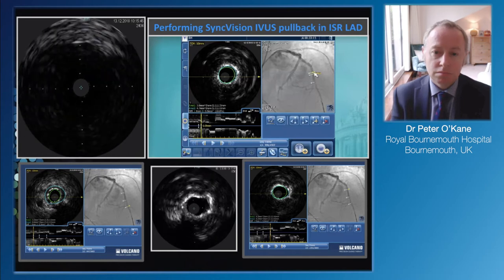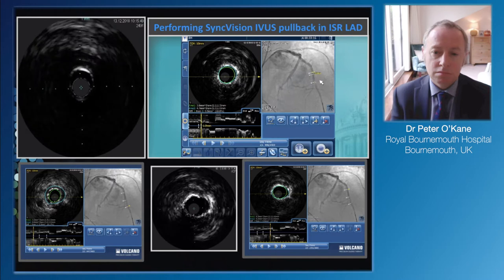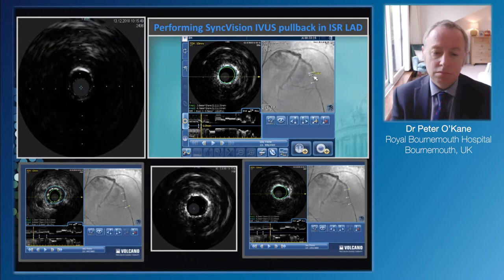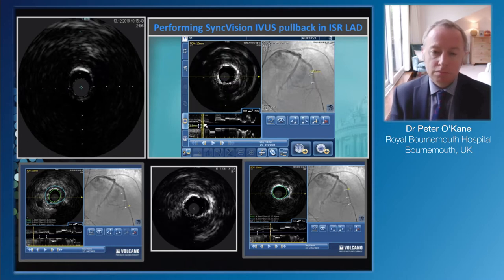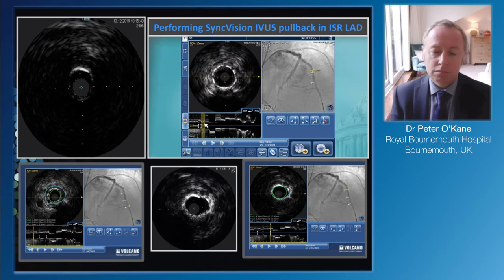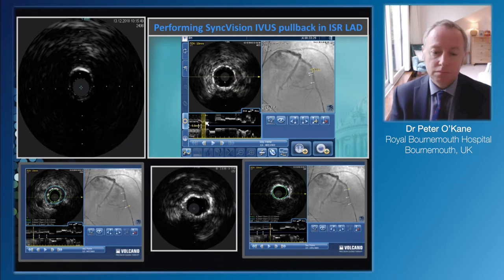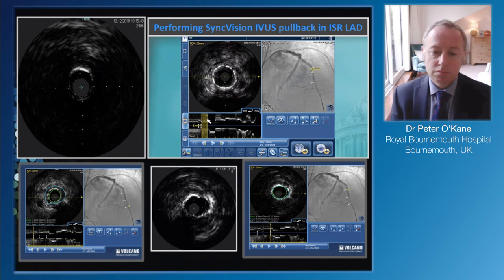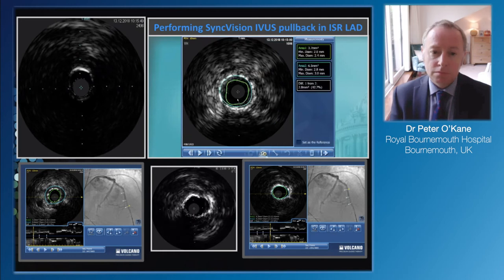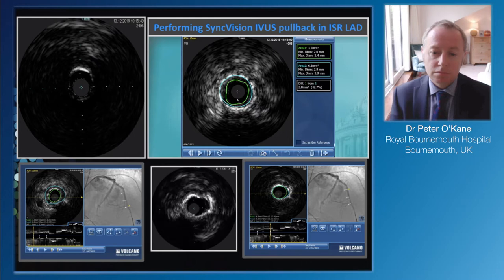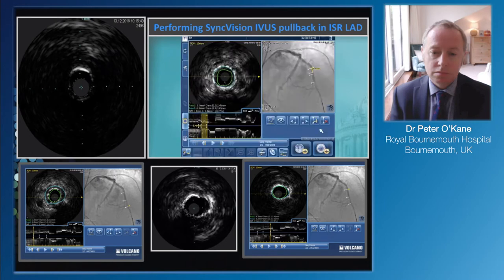The co-registration is quite useful. The lesion is around here, which is paradoxical to the angiographic lesion location, but that's what we're actually needing to correct. The stent has expanded more distally. Coming a bit further proximally, the measurement looks bigger at 6.3. So 4.7 versus 6.3 - quite a big difference. I think we are dealing with some under-expansion at that second bookmark point.